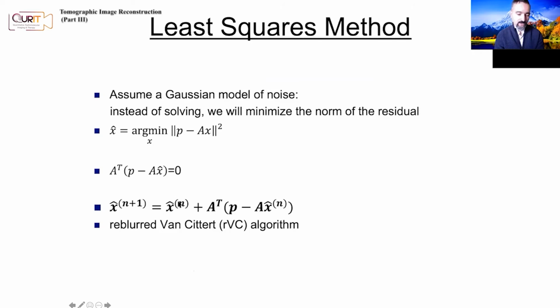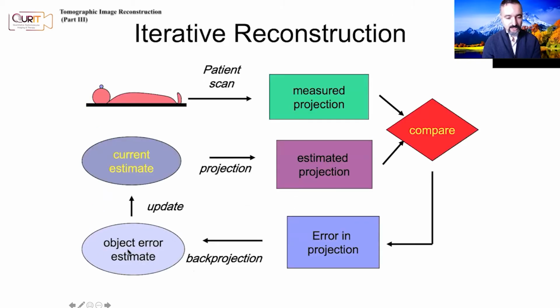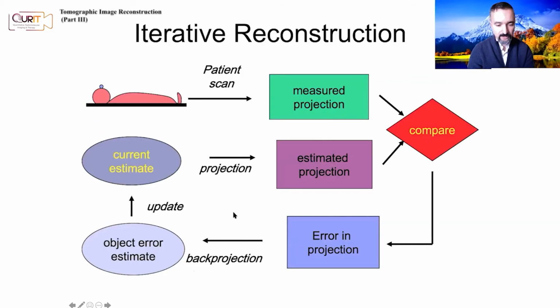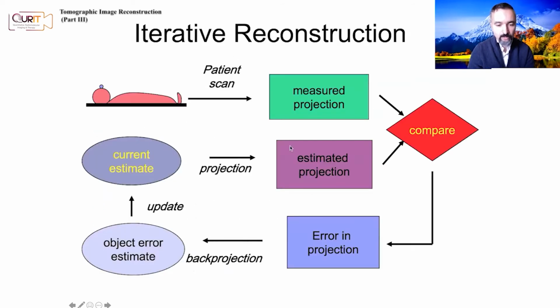So this is kind of saying, oh, that was not a good guess. You have to add this extra factor to it, and then do the update. So you get this extra term, and then you add it to the image. You have this error term that has been computed, and you add it, and you just go through the steps. And you go through this loop until you get a reasonable image.